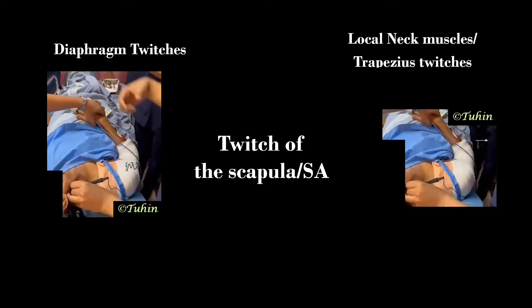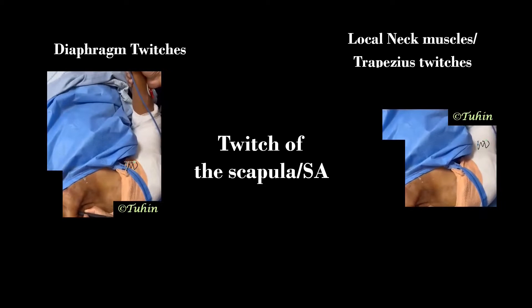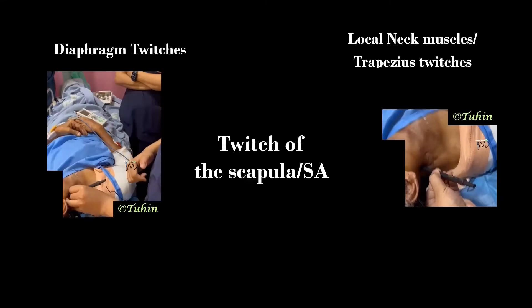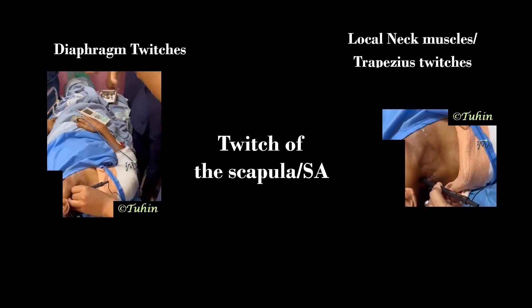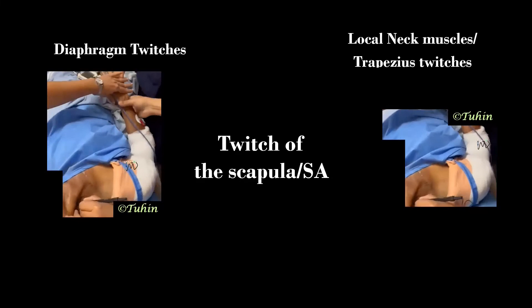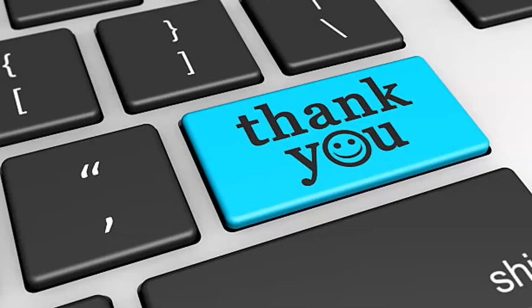Twitch of the scapula or serratus anterior muscle results from stimulation of the long thoracic nerve, which is posterior or deep to the brachial plexus. Here we have to withdraw the needle, reassess the landmark, and then reinsert the needle accordingly.